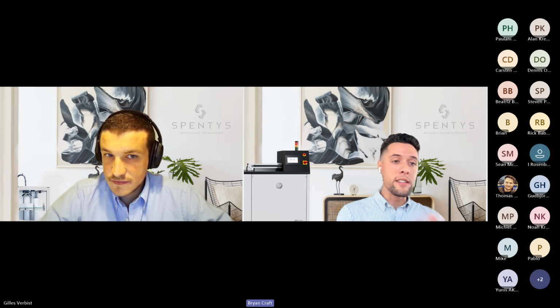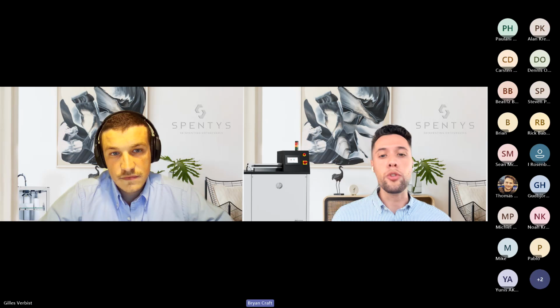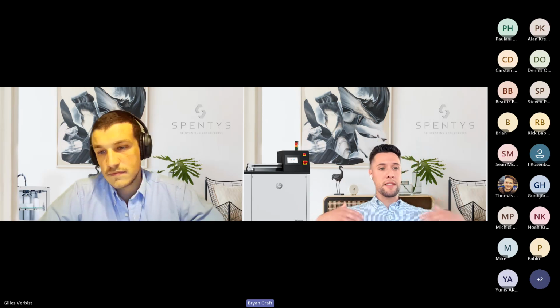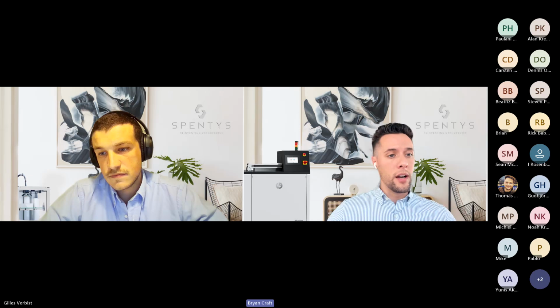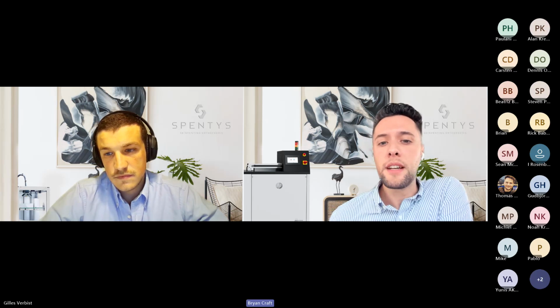In addition to our traditional fabricated devices, which have worked well for so long, we're now offering a new way of doing things. We're seeing that work out very well for the partners that take on that service. And we're just in the background as your software partner, making sure everything's running well and to your standardized approach. And you get all the credit with your partners. And that's nice.